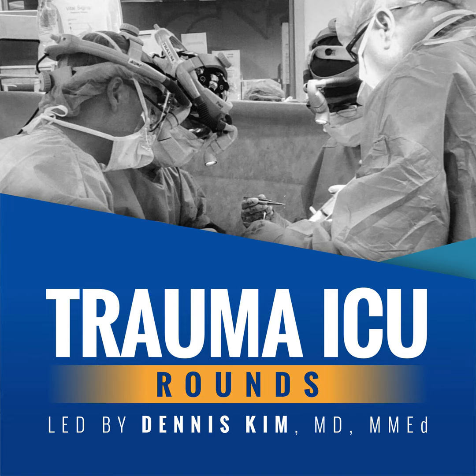There are several advantages to pressure ventilation. These include preventing overdistension by setting a maximum pressure or controlling the peak alveolar pressure, which is the pressure most closely related to the potential for VILI, or ventilator-induced lung injury, such as barotrauma or volutrauma. It may also be more comfortable for patients who are breathing spontaneously, as the negative pressure produced at the upper airway causes the ventilator to vary gas flow delivery to match the patient's need. Further, there's usually a longer duration of inspiration with pressure control ventilation, which may improve oxygenation.